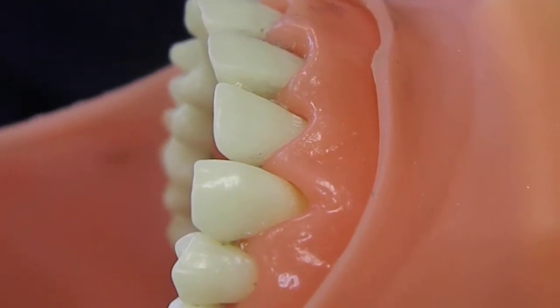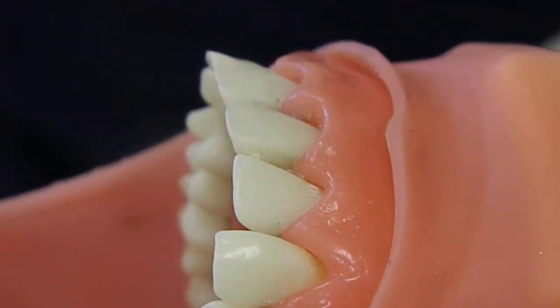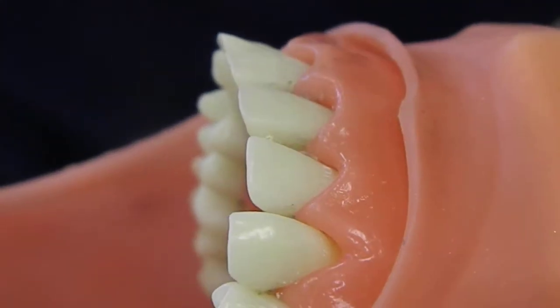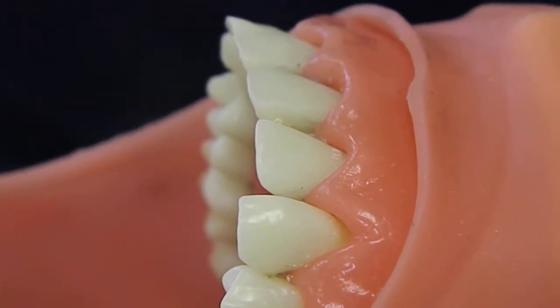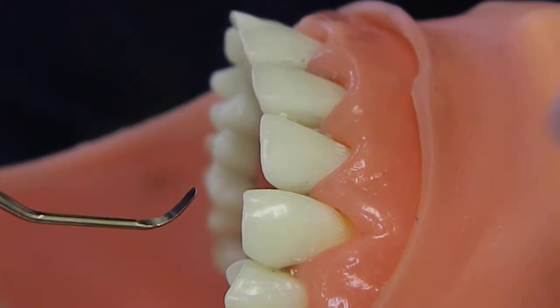This tutorial is about the anterior Gracey. It is also a subgingival instrument. It's a little bit more tricky to determine the correct end because it has a straight shank.